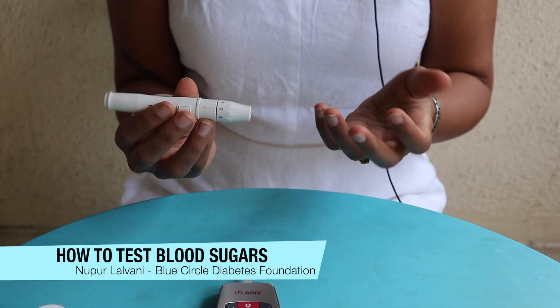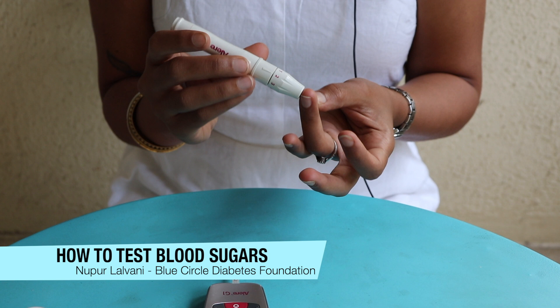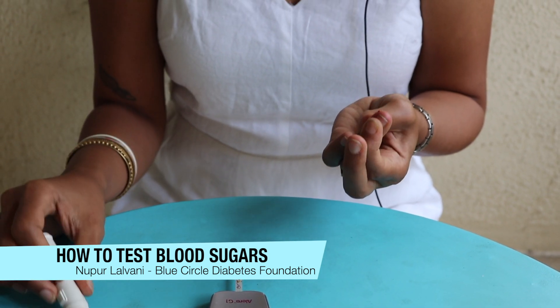Now we prepare the lancing device. Select a finger of your choice and ensure that your hands are clean — washed with soap and water or cleaned with an alcohol swab.